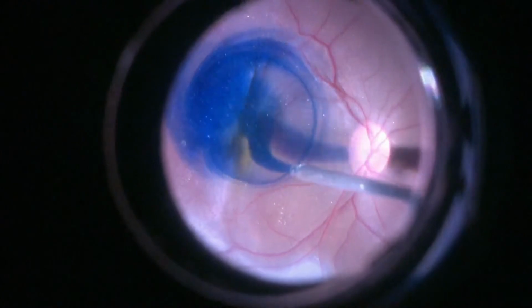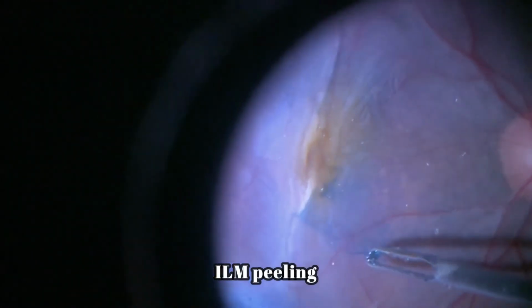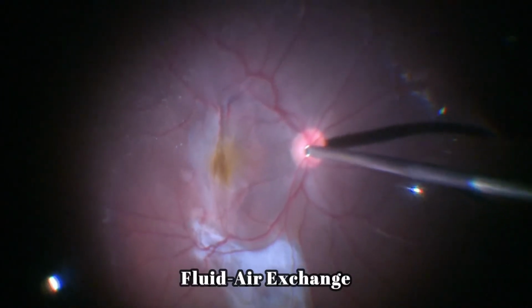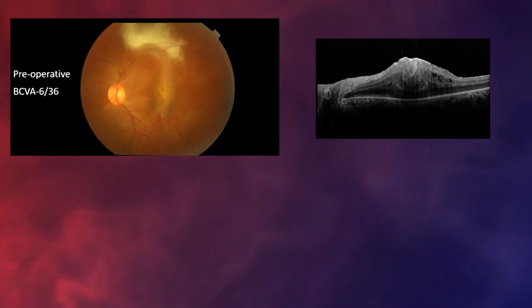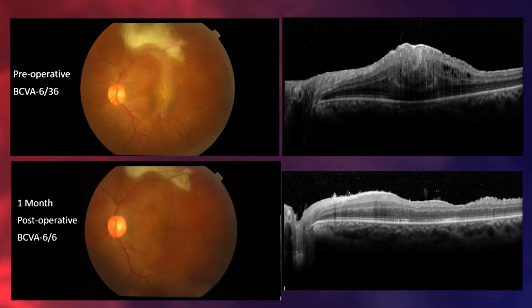Brilliant blue dye staining was followed by internal limiting membrane peeling and fluid air exchange. The peripheral retina was screened with closure of the case. The 1 month post-operative best corrected visual acuity was documented to be 6/6.